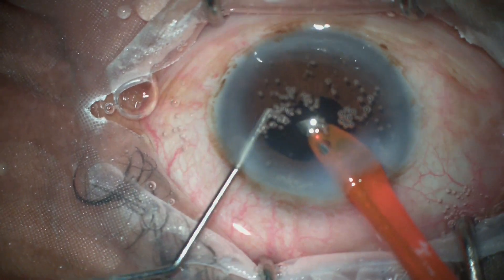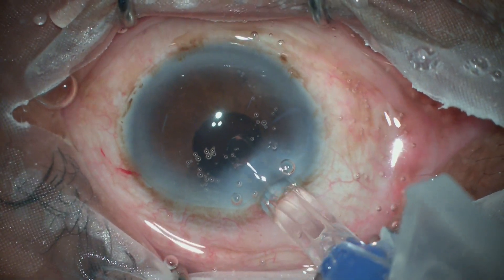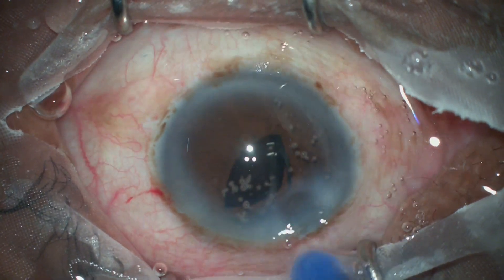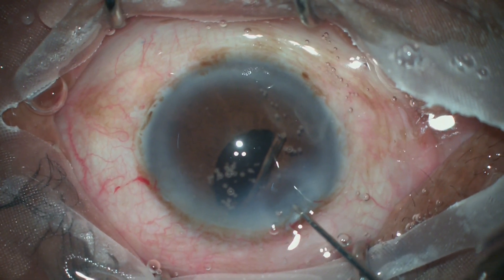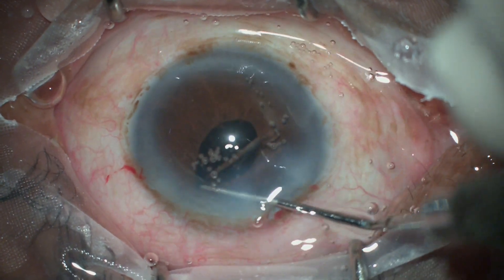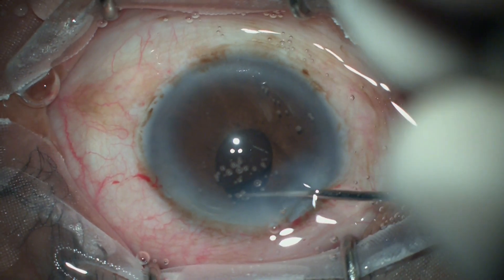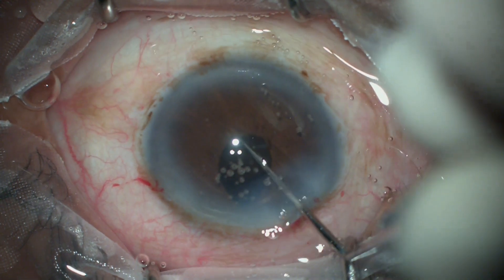Once phacoemulsification is complete, we proceed to implanting a foldable single-piece monofocal IOL. The IOL goes into the bag and the pupil has become very small. However, this is not a concern since the majority of work requiring a well-dilated pupil is finished. The IOL is dialed into place so that both the haptic and the optic go into the bag.